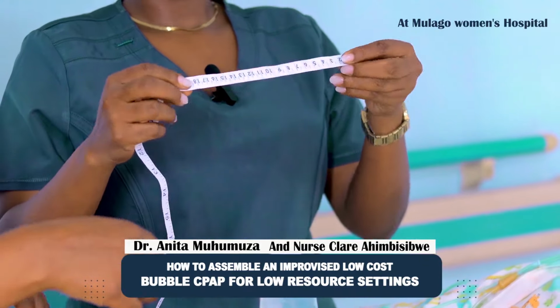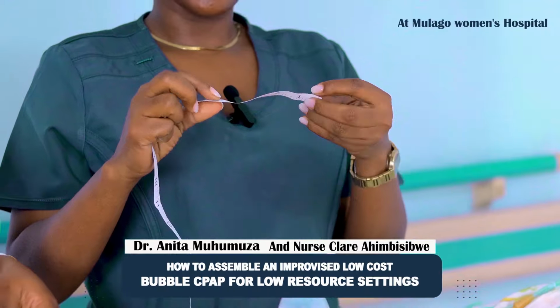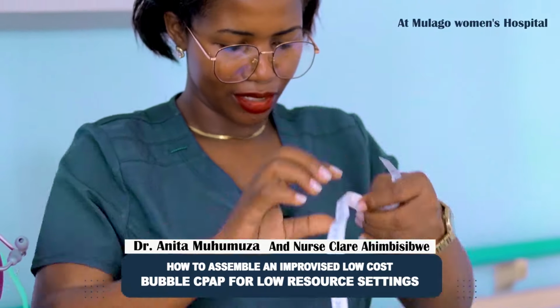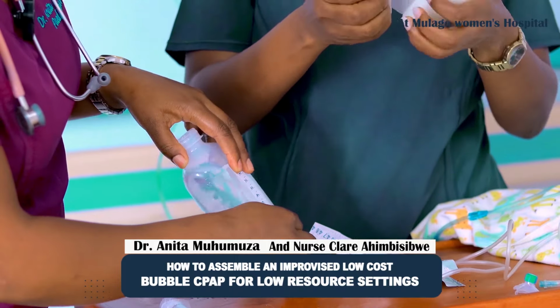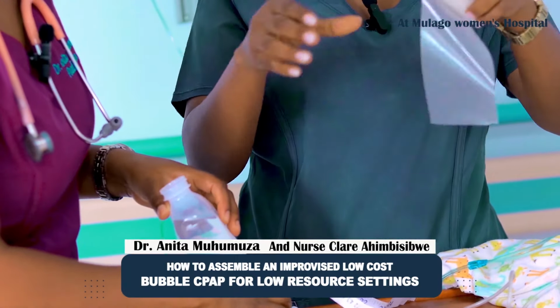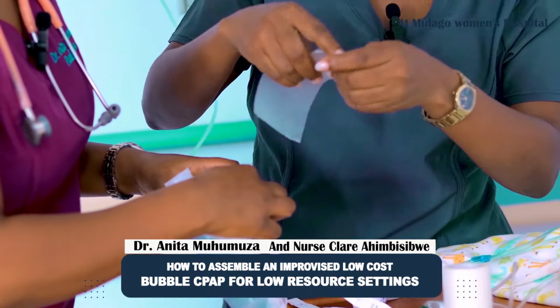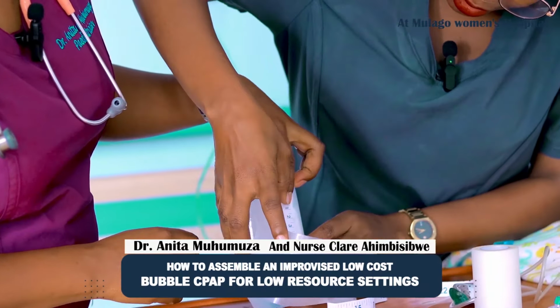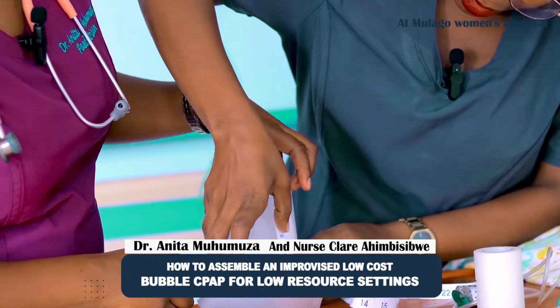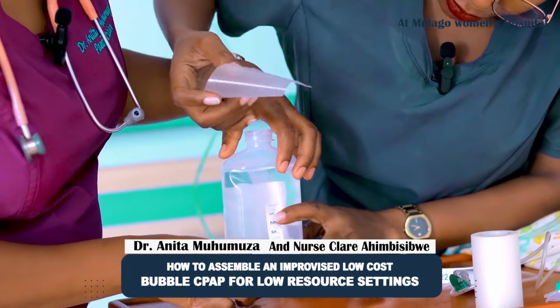With our tape measure, we need centimeters from 0 to 10, and then we shall use our transparent plaster to secure it. From 0 to 10, and 10 is at the bottom, as you can see.